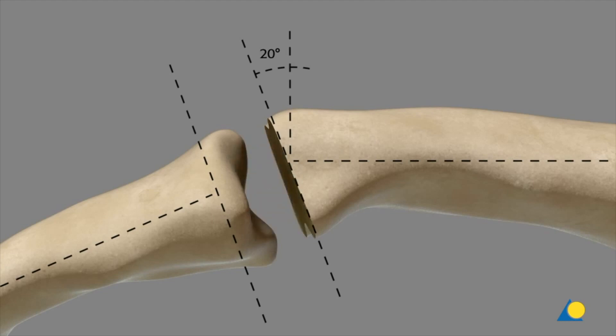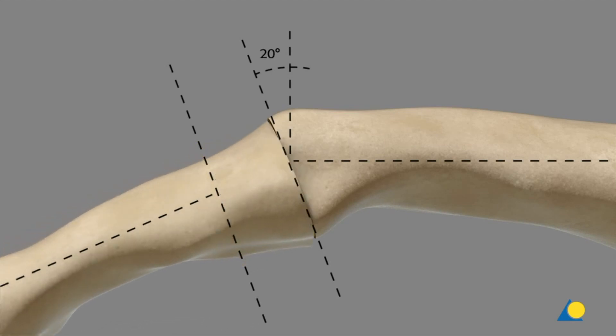Depending on the angle of the arthrodesis, the osteotomy is performed through the head of the proximal phalanx, while the base of the middle phalanx is resected perpendicular to the longitudinal axis.